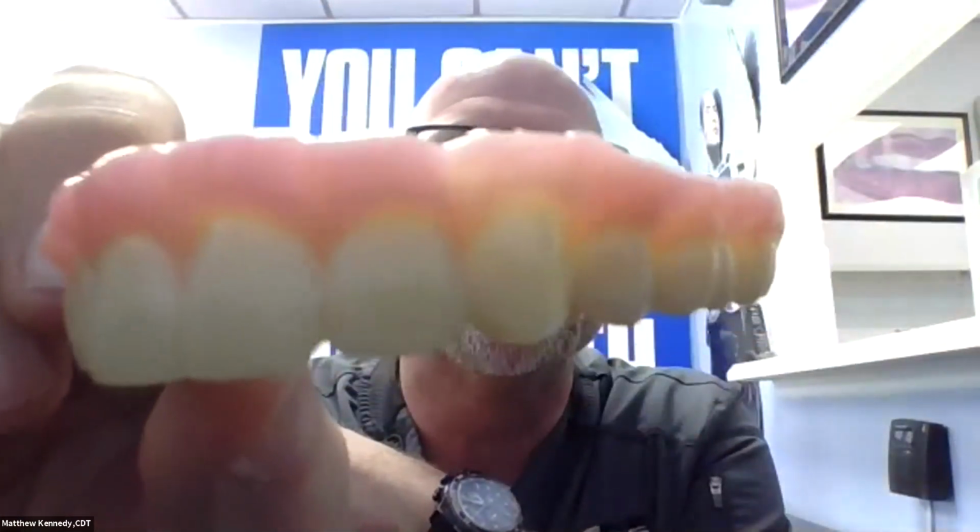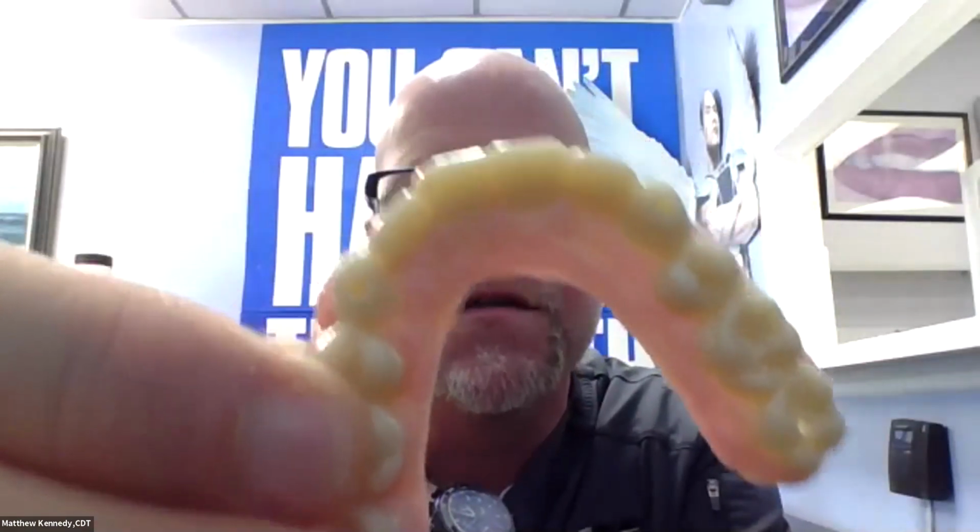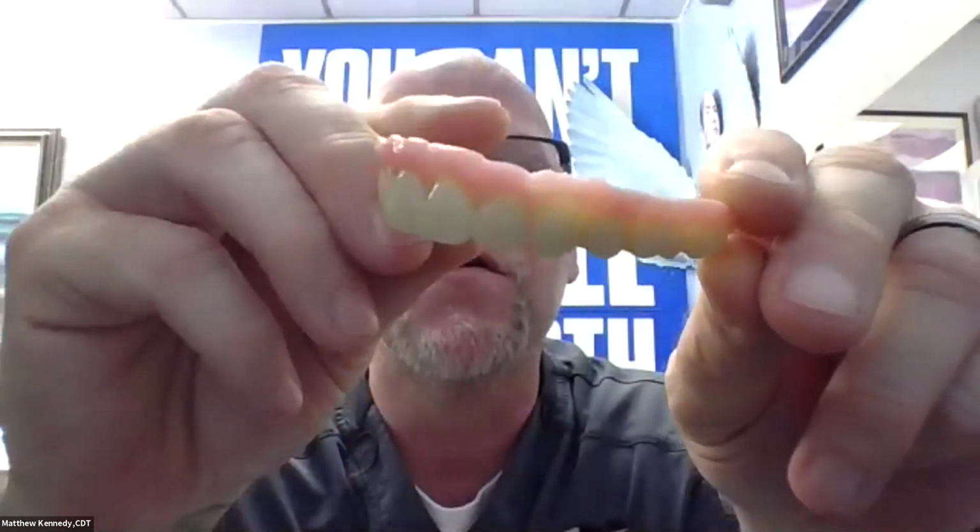The conversion denture. So here is the conversion denture we did. We just used some Triad pink around the facial and around the palate. And we use Triad because it's just simple and it's in sheets, no other reason more than that. And then we have a nice aesthetic scenario to go in for the conversion.